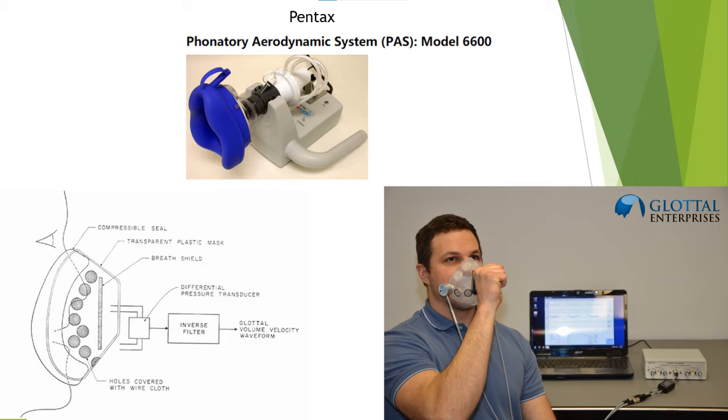If you want to measure flow rate, you have to use one of the modern measurement setups referred to by Jack Young. We have been involved in the development of the aerophone made by FJ Electronics. Rothenberg made his mask many years ago, and Glottal Enterprises developed it further.